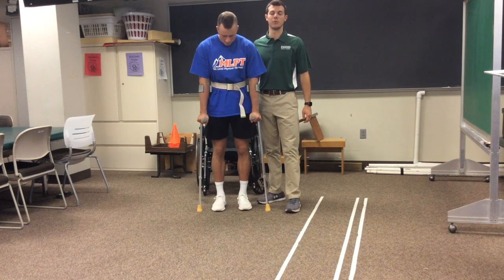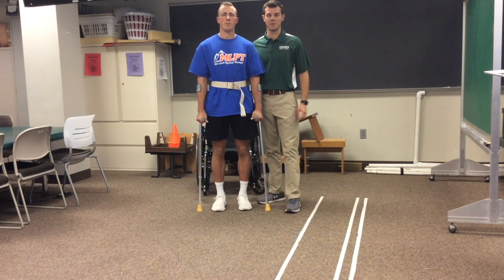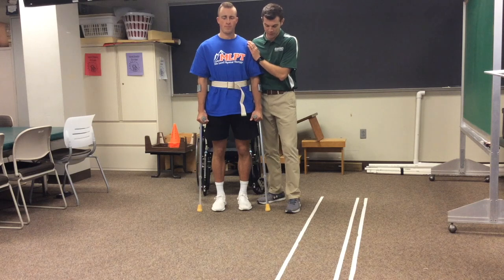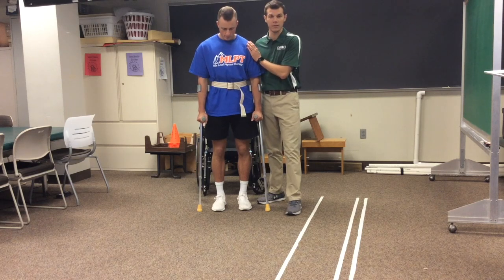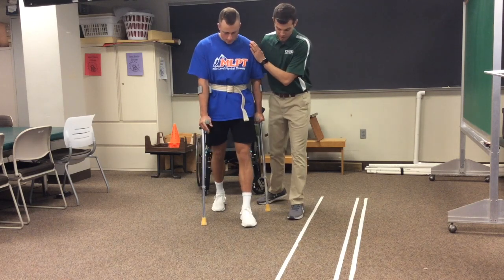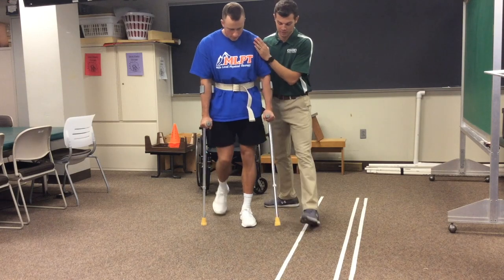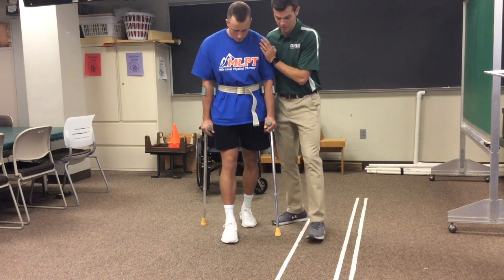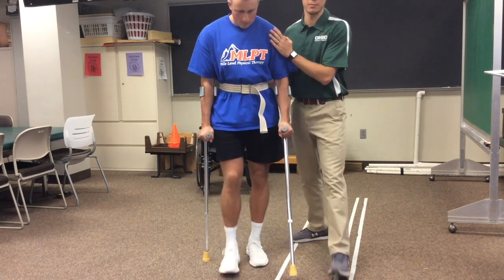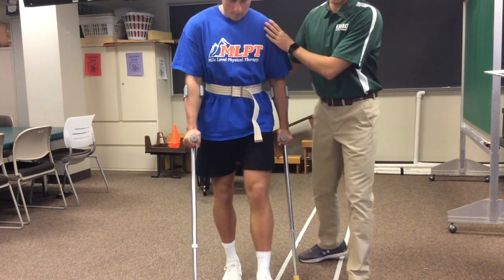And now for the two-point gait pattern, recalling the proper positioning, Josh is going to advance his right crutch and left foot at the same time. And now his left crutch and right foot at the same time. Continue the sequence. I'm maintaining proper positioning, and Josh is as well.